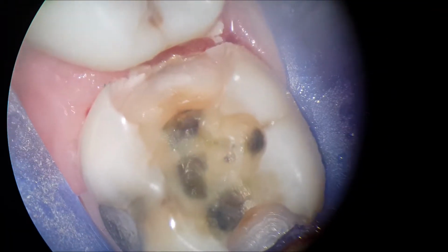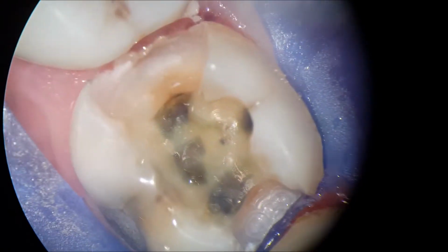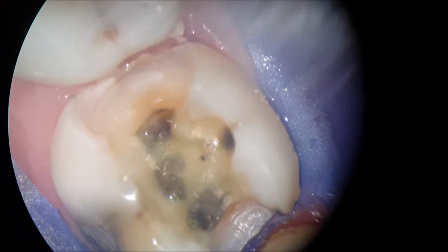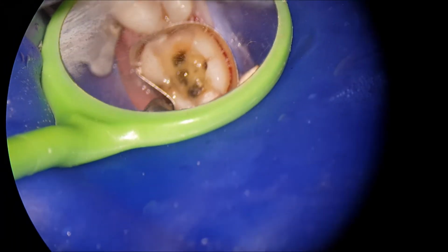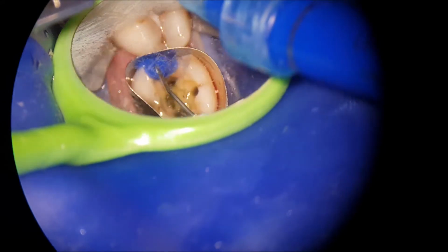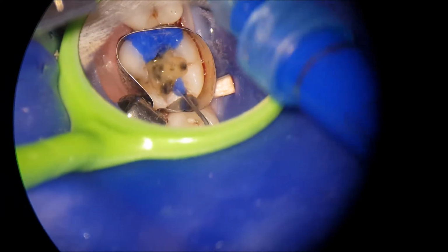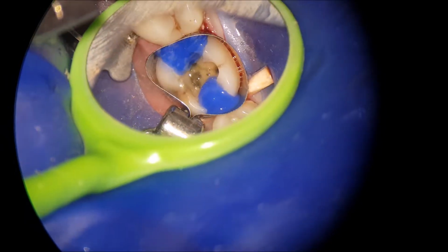The referring dentist basically just queried the lesion, and making the decision to initiate the endo wasn't an easy one. I mean, what are we going to do? We don't know the rate at which this lesion is getting bigger. I opted to initiate the endo before the resorptive lesion perforated the root. Obviously, if that happens, it's quite a bit more of a palaver to manage. If you want to scroll back at the screenshot of the cone beam CT, I think you would agree with that.